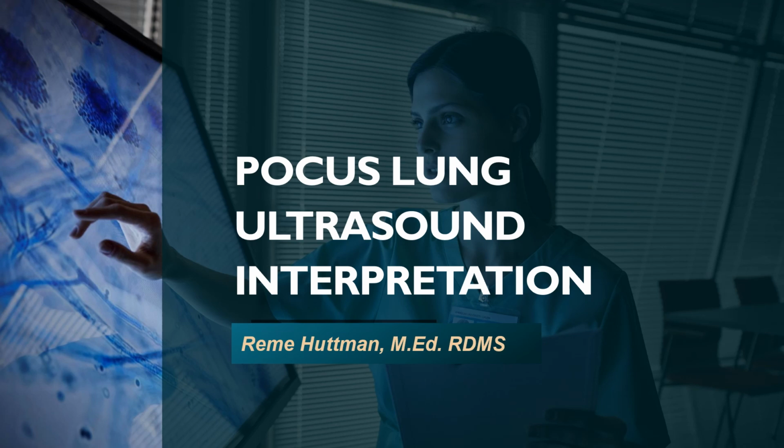Thank you for joining us again for our point-of-care ultrasound lung ultrasound interpretation lecture. We're also going to go over some details about how to evaluate for diaphragmatic excursion, as well as some needle placement and procedures for the lung and thoracic area.